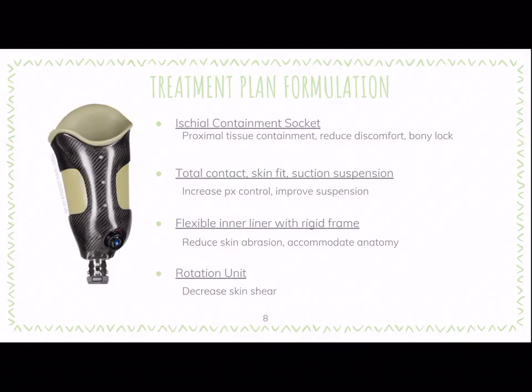The socket also has a total contact skin fit suction suspension design. This is to increase the control of her prosthetic, improve the suspension, which she currently doesn't have, as well as increase the proprioception, so she's able to control her prosthetic a little bit better.